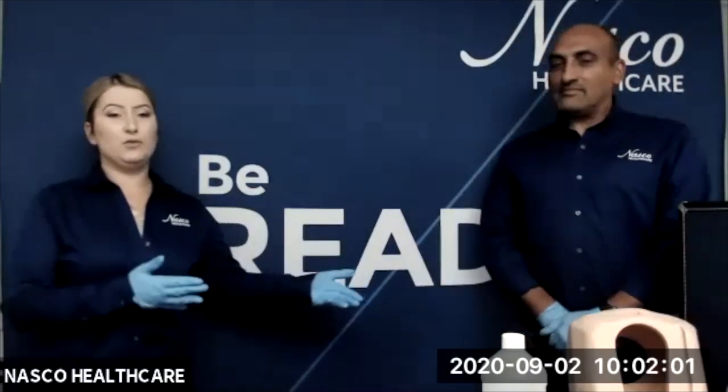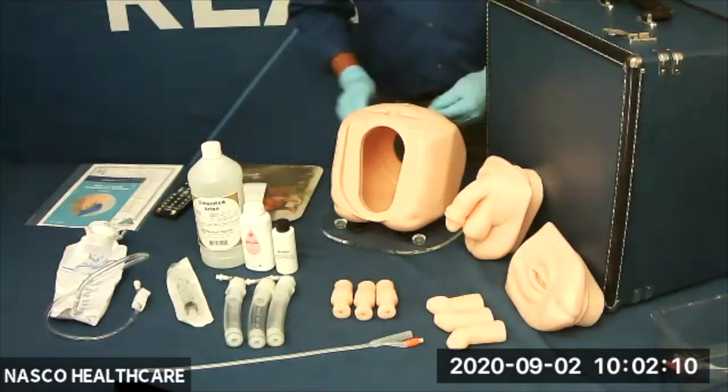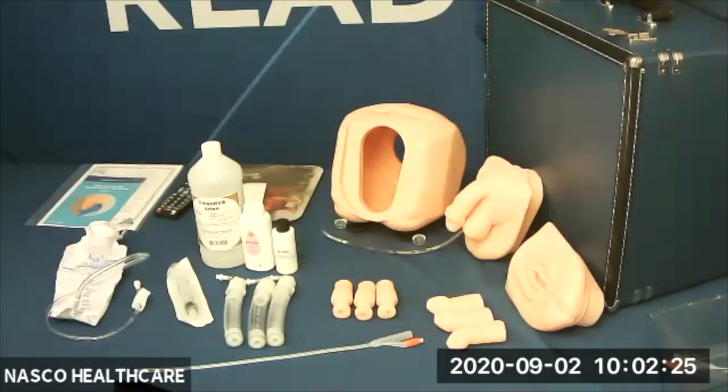We're going to zoom in and start our presentation. Today we will begin by talking about our new male and female catheterization simulator. It is an evolution of our existing catheterization simulator and provides realistic training for urinary and suprapubic catheterization. This improved catheterization trainer is configurable between an adult male or female using the included interchangeable genitalia. The additional new features include a foreskin option as well as enema and rectal exam training.